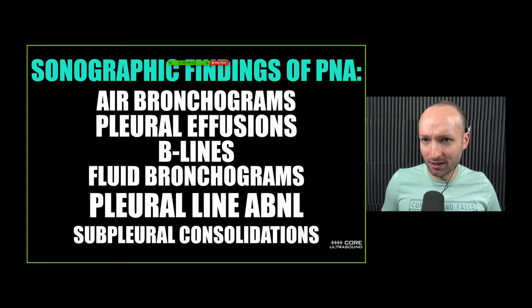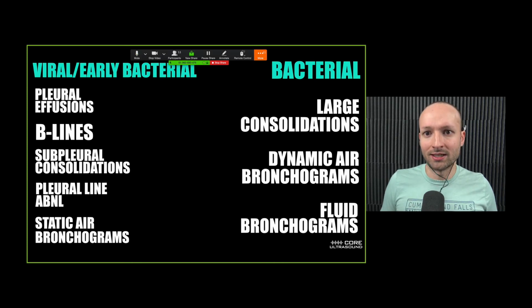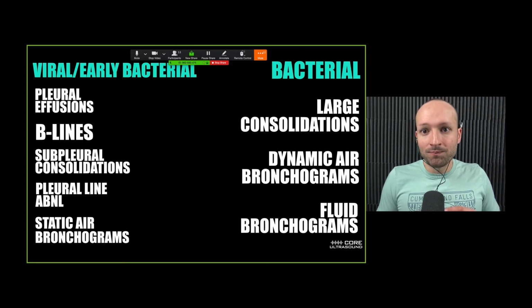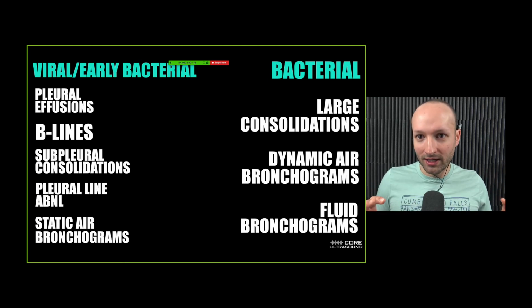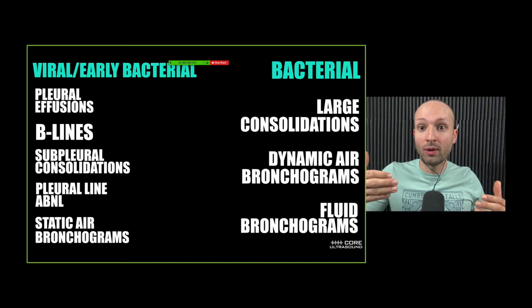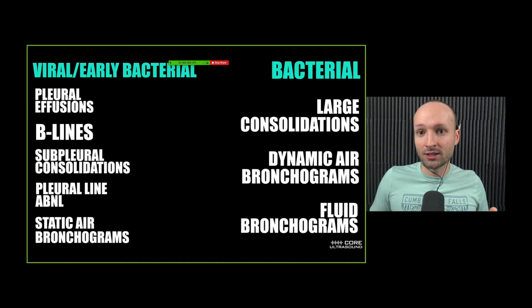So these are all the findings that we talked about. One of the trickier things is when people ask me, what's the difference between a viral pneumonia and a bacterial pneumonia? And I say that the main thing is that you're not doing an ultrasound as your primary and only way of diagnosing something in your patient. The ultrasound is a tool in your toolbox. You're not just going to close your eyes, only look at the ultrasound screen, and start scanning them, right? You have a pre-test probability, a pre-test differential diagnosis that you are working with before you do that ultrasound.